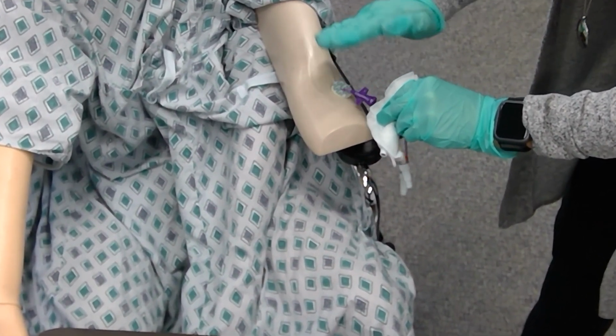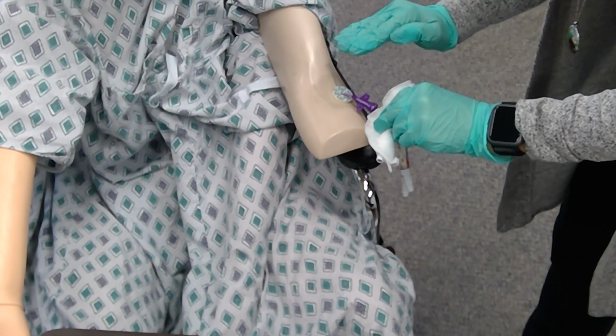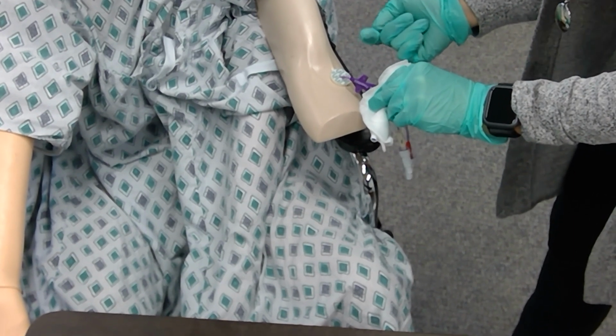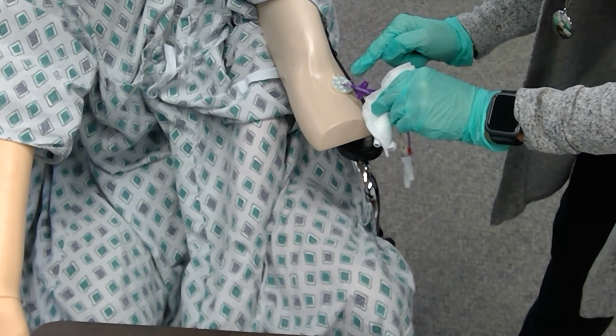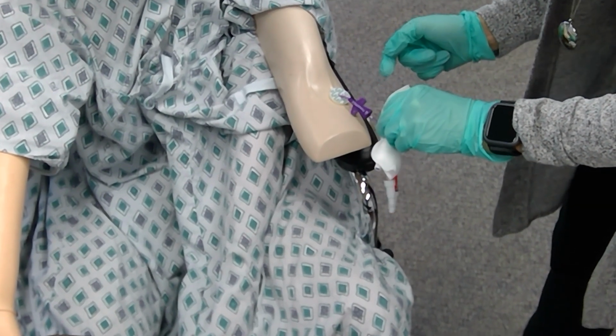Because when you take this dressing off, ideally the biopatch is also going to come right off. Do not twist the biopatch around and get it stuck when you're trying to pull that dressing off. So the patient's line is going to set directly on that slit.